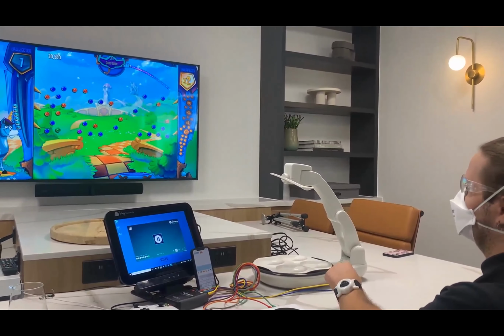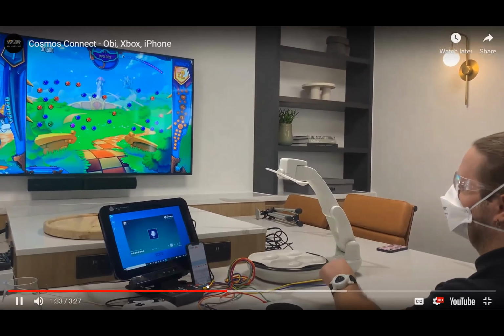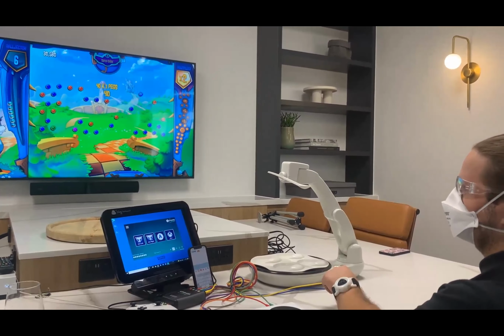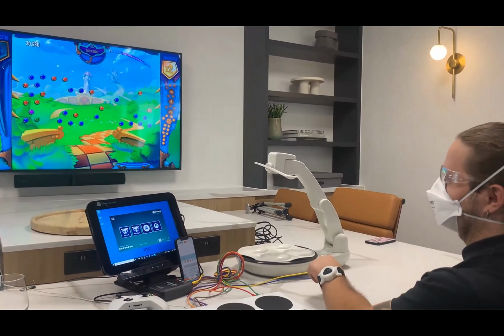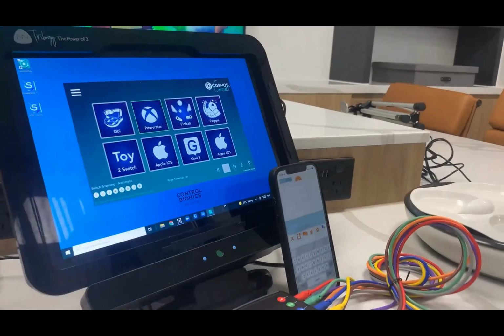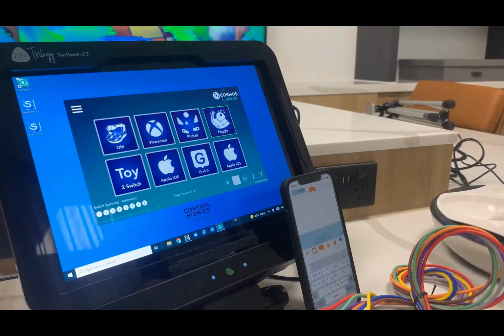And so what you're seeing here, right under the device, is the Cosmos. It can now plug into your external devices. It can control up to 8 wired devices and 1 Bluetooth device, based on what I saw on the internet, the World Wide Web.